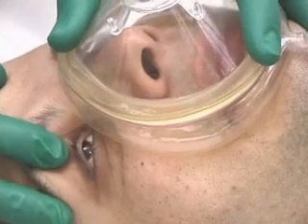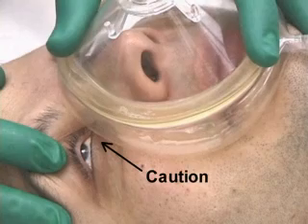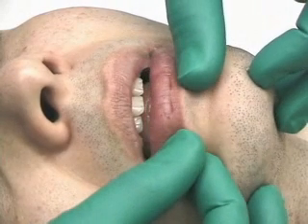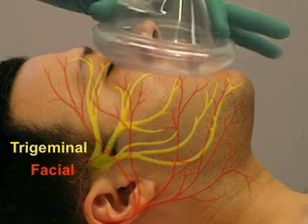Complications other than the inability to ventilate can occur, including corneal abrasions and blindness in the presence of a severe eye injury. Soft tissue injuries, particularly to the bridge of the nose and lips, may result when excessive pressure is applied. Complications such as trigeminal and facial nerve compression have been reported due to continuous prolonged pressure on the facial structures.